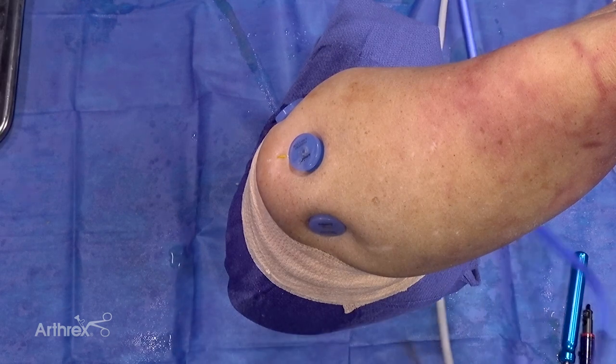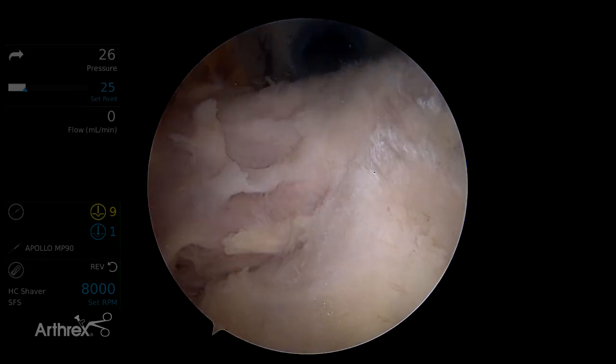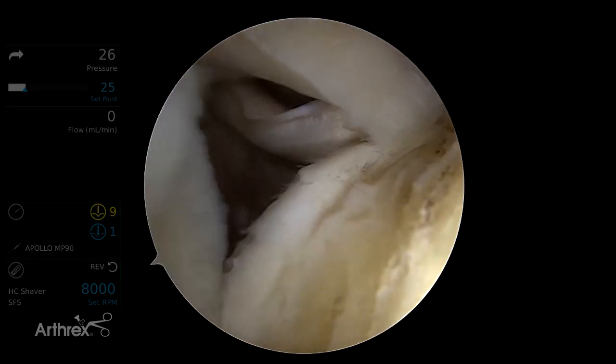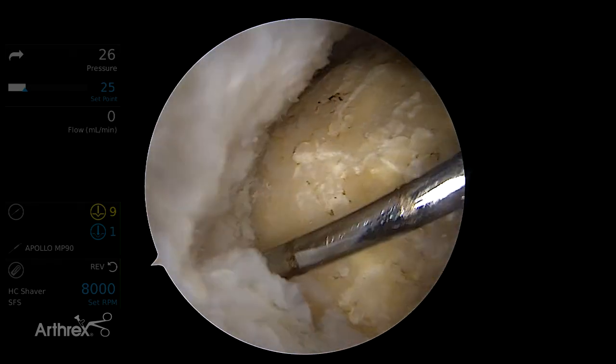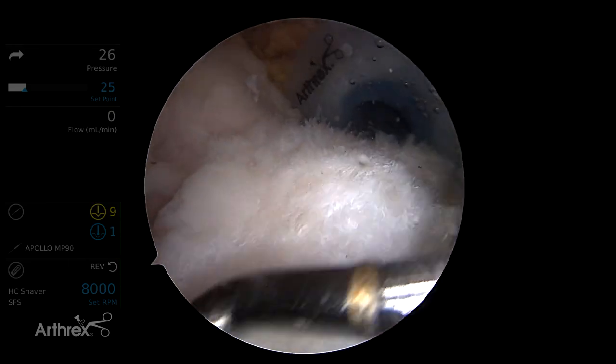This is a right shoulder, so we have our portals in place with posterior viewing portal first. Here's our tear — you can see anteriorly, here's our biceps tendon, and posteriorly back through the infraspinatus, so muscle tendon junction right about here.